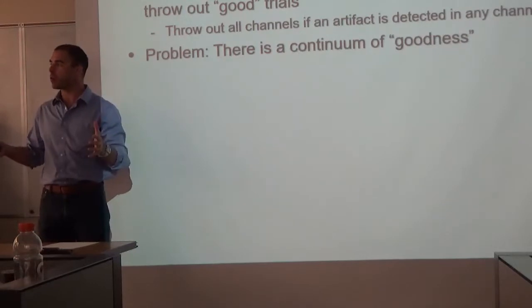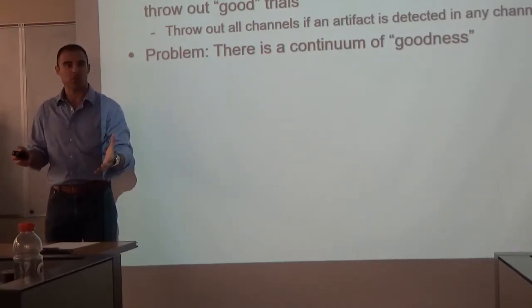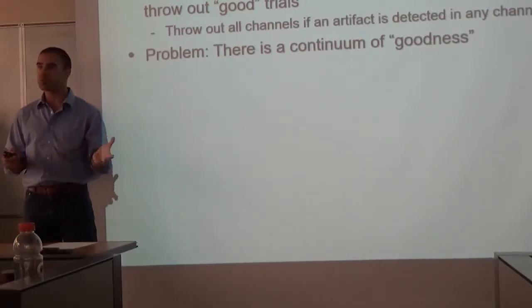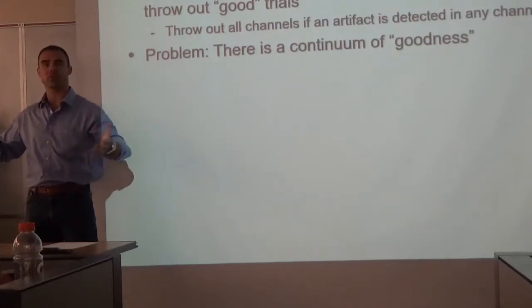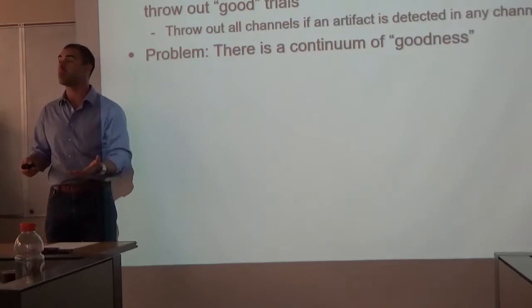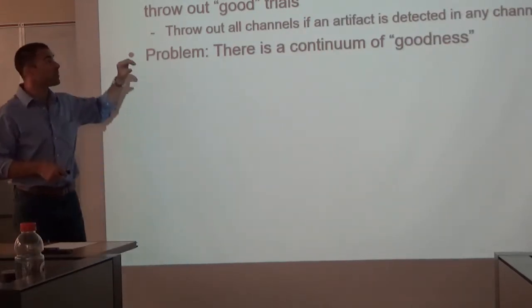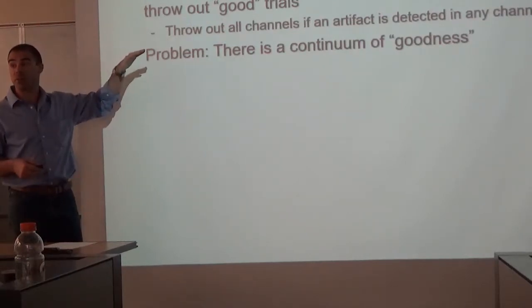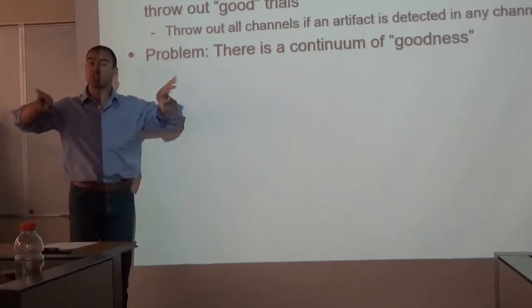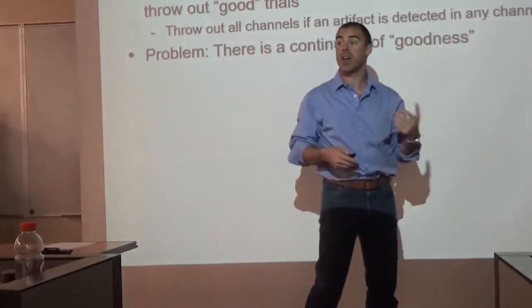Because all we care about, right, as psychologists in this situation, we care about the brain. We don't care about muscle activity. We care about the brain activity that we're measuring. Anything else besides the brain activity is stuff we don't want to know about, or at least we don't need to. And in fact, things that might interfere with the signals that we do want. So, we have this problem that within all the good data that we have, we also have a mix-in of bad. And we have to do that proverbial sifting of the signal from the noise, the wheat from the chaff.